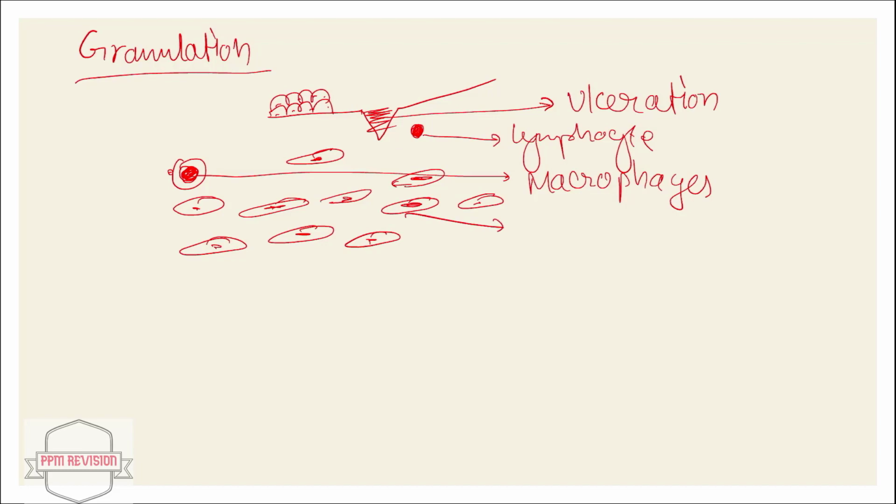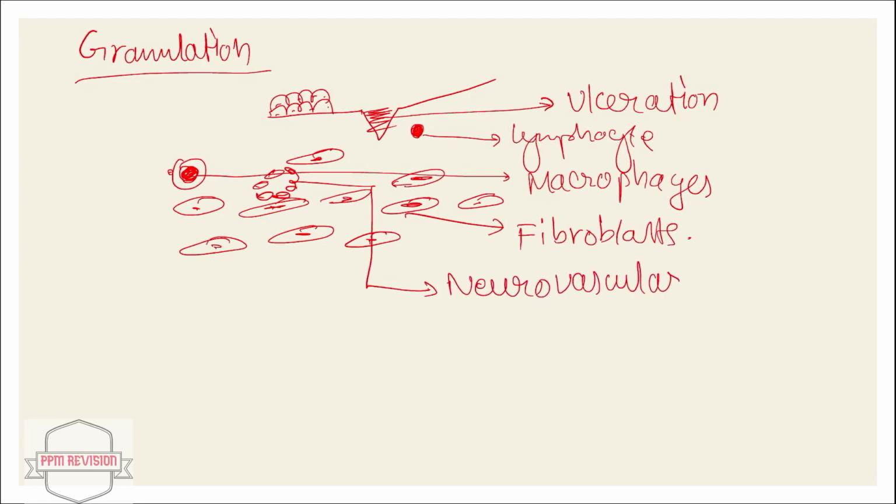So here we have almost done. We can see this is a completely rough diagram, so it's just mainly to highlight what is present. There's presence of fibroblast and also there's presence of a neurovascular bundle. Just to highlight a few points.